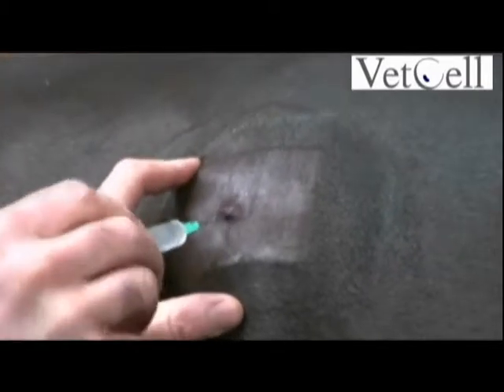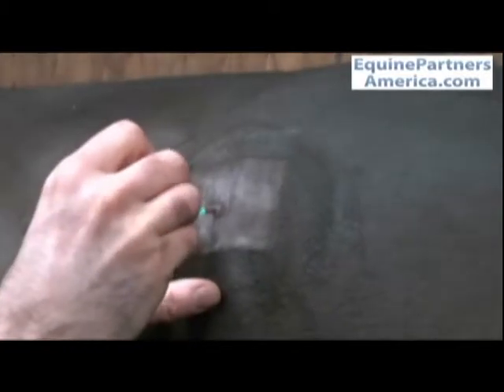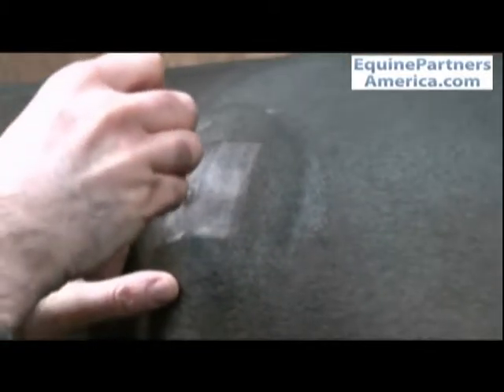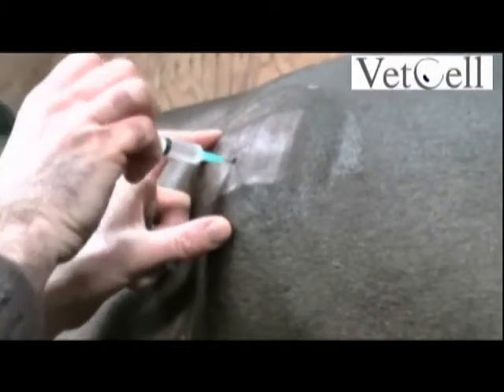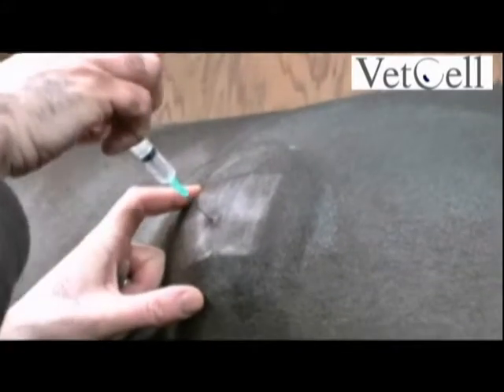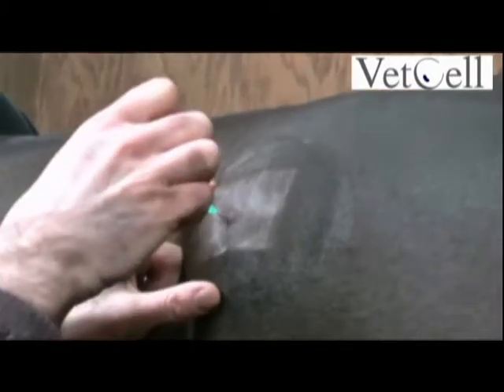It's more like the wing of ilium actually. So a bleb where the needle is going to go in. This is a one and a half inch needle — go all the way down to the wing of the ilium. What I do is inject local and get an idea of the contour of the bone, so I know how the needle tip is going to behave when it touches it.